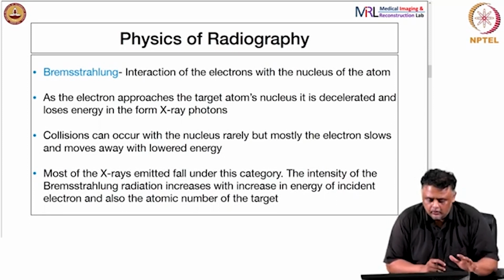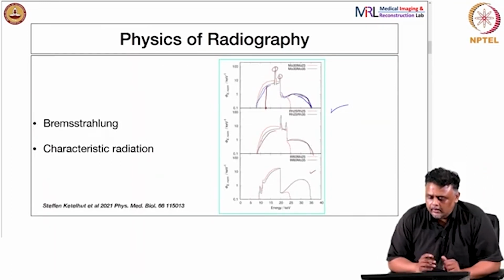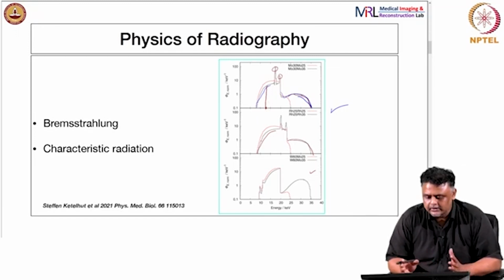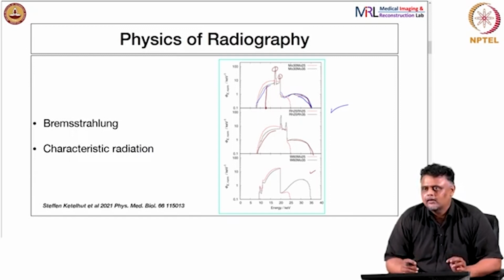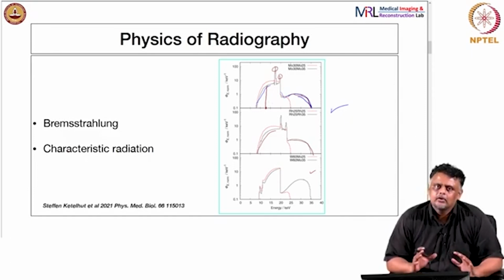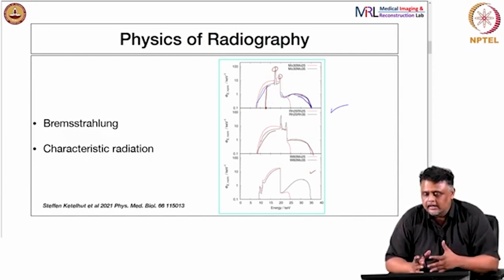Another point to note, going back to the spectrum, is that the spectrum is a function of energy. That is why it is called a spectrum. Whatever comes out of a typical X-ray tube has an entire range of energies; it is not monochromatic. When you do analysis or reconstruction, you typically end up assuming an average energy, or a monoenergetic beam, but that is not entirely true. You will have this range of energies, and this range is determined by the accelerating potential.